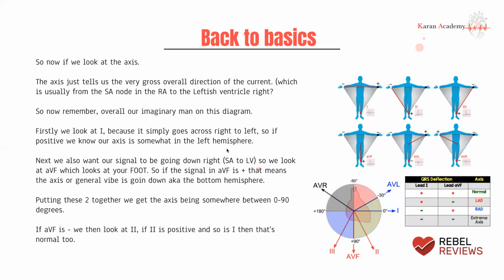Now let's look at the axis. As I said, what the axis basically tells us is, if you could summarize the entire direction of cardiac activity in one angle, what would that angle be? So let's just pause there and just look at this picture here. This is your heart, right?